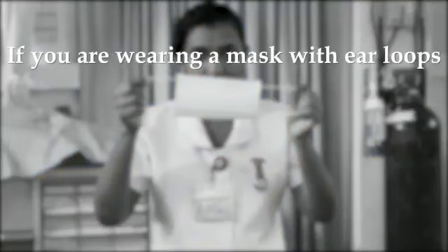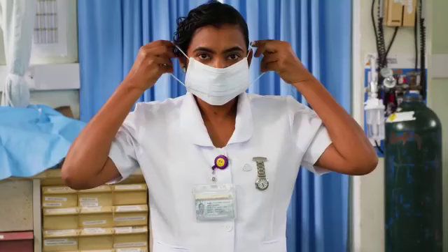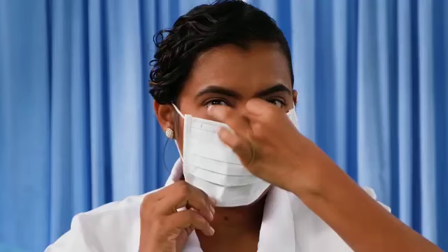If you're wearing a mask with ear loops, hold the mask by the ear loops and place a loop around each ear. Mold or pinch the stiff edge to the shape of your nose. Pull the bottom of the mask over your mouth and chin.